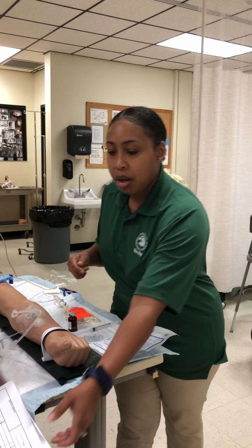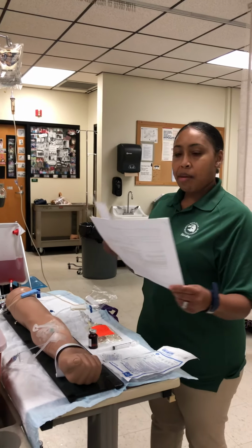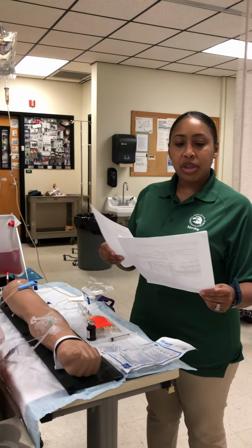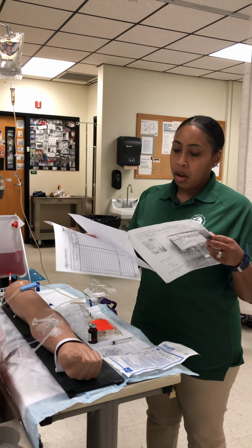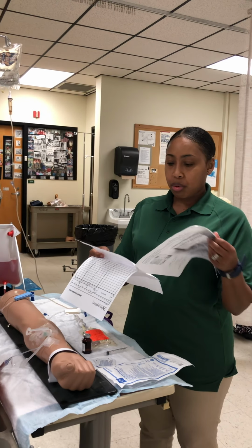Hi, Miss Martin. My name is Kimberly Dawes, and I'm here today to do my IV push and my IV piggyback competency. The first thing we're going to do is check our physician orders against the MAR. We have an order for gentamicin 60 milligrams every 12 hours, IV piggyback, and an order for furosemide 30 milligrams IV push every 6 hours.